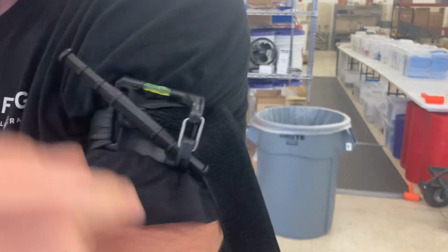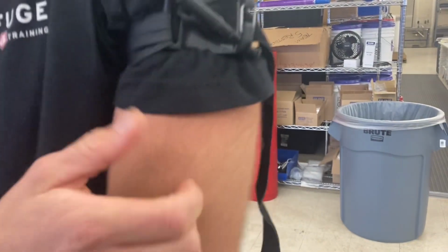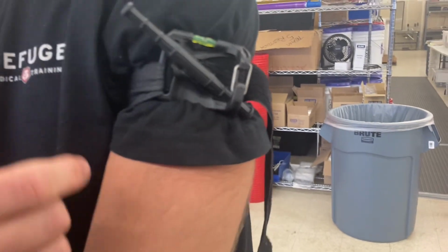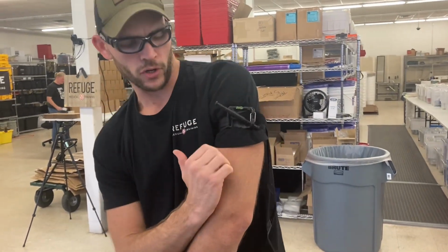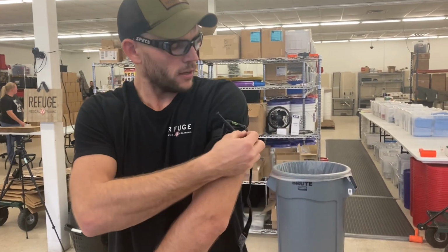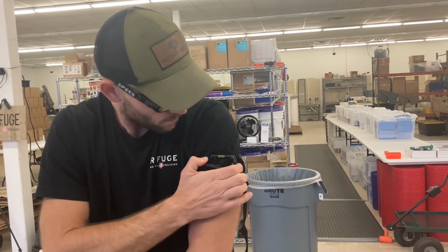But it is still torquing. How's it look on the backside? Because I can't see it. Right, it's actually pretty straight on that backside. Okay, but yeah, this is still doing the same thing, and it required me to torque it a specific direction, which under stress was the opposite direction that you would train to do. We all use our thumb more than the other fingers, so if you're going to torque it, you're going to use your thumb as leverage. Right.